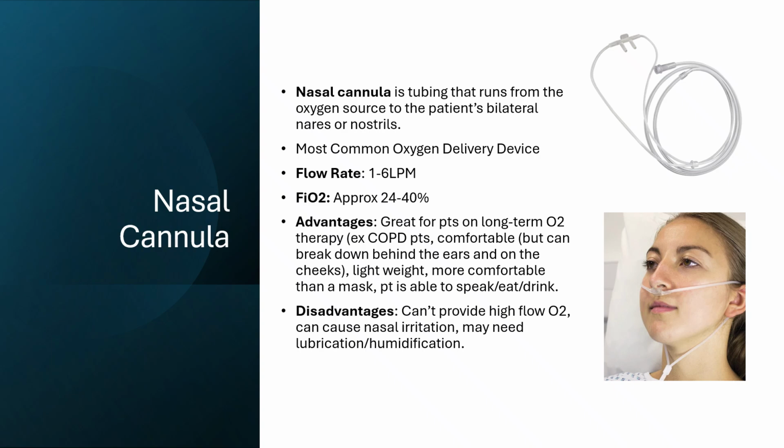Now, some advantages. It's great for patients that are on long-term oxygen, so think about your COPD patients, and it is pretty comfortable, but it can break down the skin behind the ears and on the cheeks. So sometimes people will put padding on the cheeks if this is something that they're wearing often.